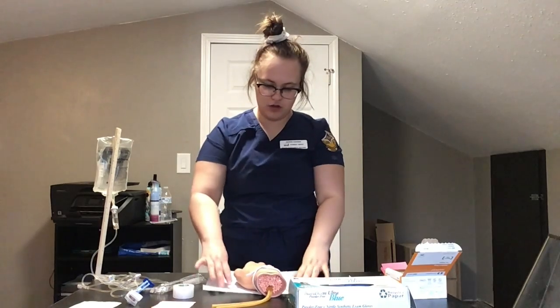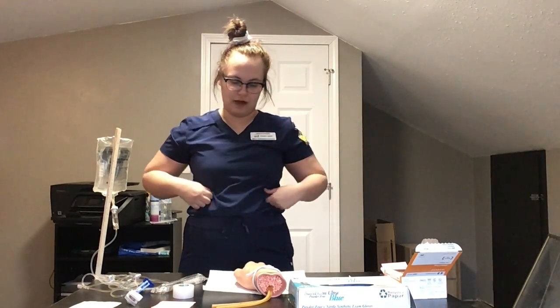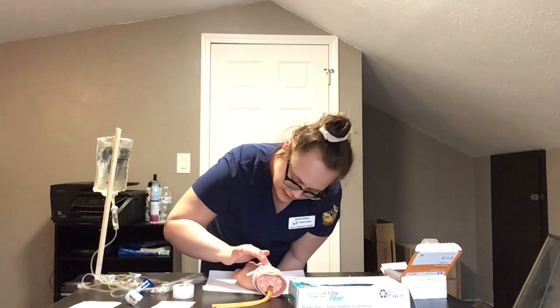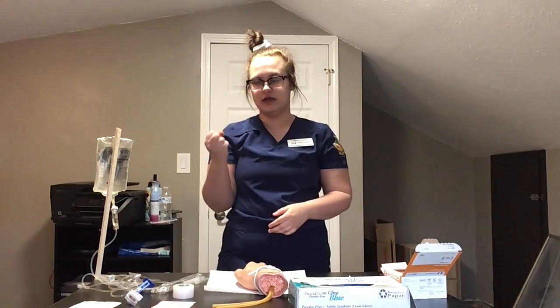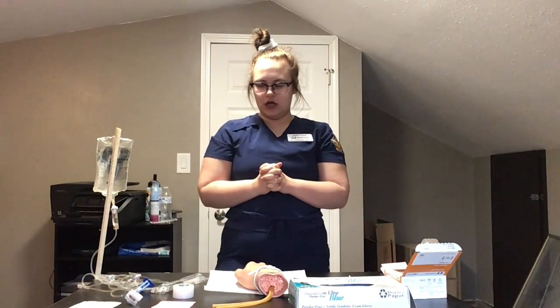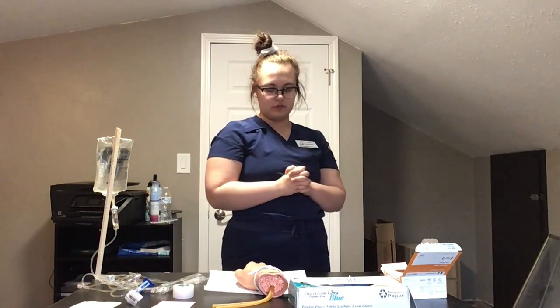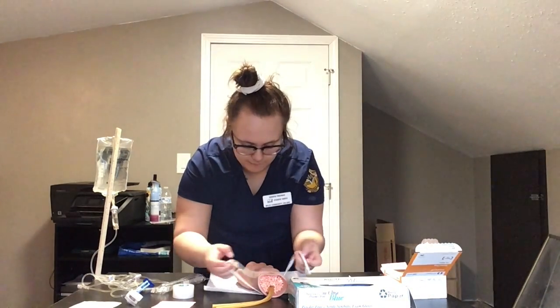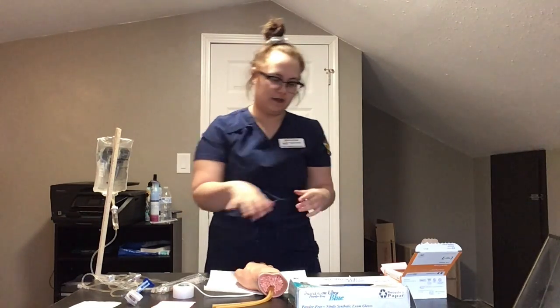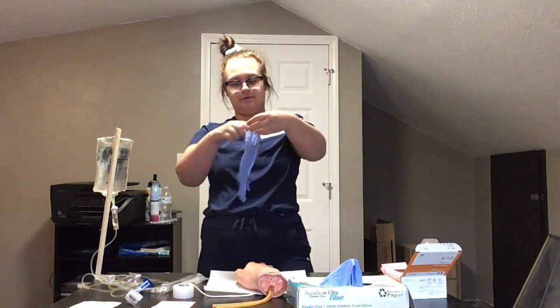Okay, now I'm going to locate a vein. So I'm going to palpate the vein that's distal. And if it's not rebounding like it should be, then I can ask the patient to open and close his or her hand. I could place a warm compress on it. I could also stroke the vein. Okay, so now I'm going to take the tourniquet off, and I'm going to perform hand hygiene. And then I'm going to put on clean procedure gloves.